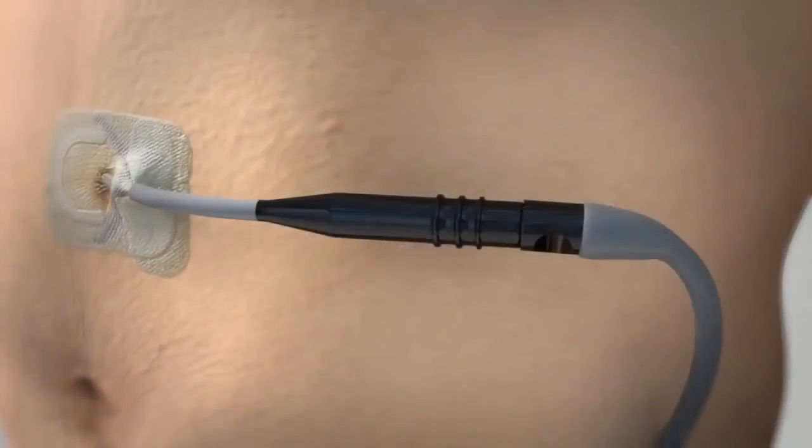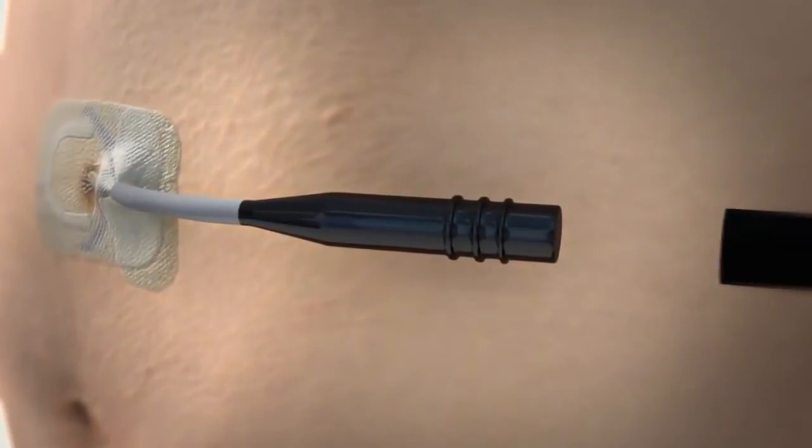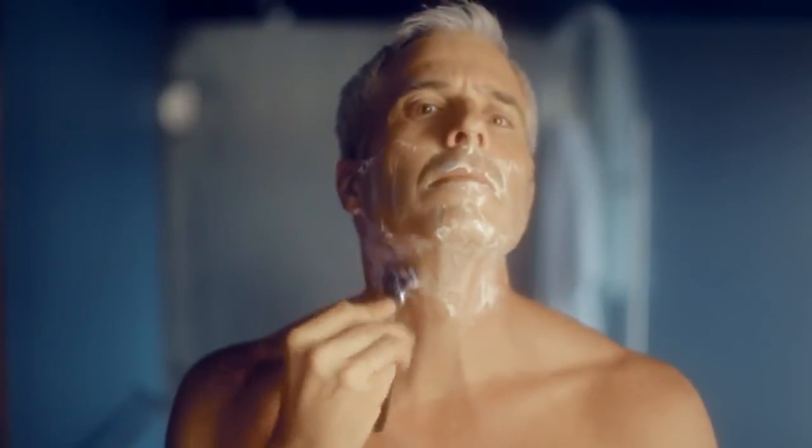First, the power button is pressed to turn off the driver. Then, the driver is disconnected and the percutaneous interface lead end is capped off. It is recommended that the patient limit disconnection to a 15 to 20 minute period in order to maintain therapy, providing a better opportunity for the heart to improve.